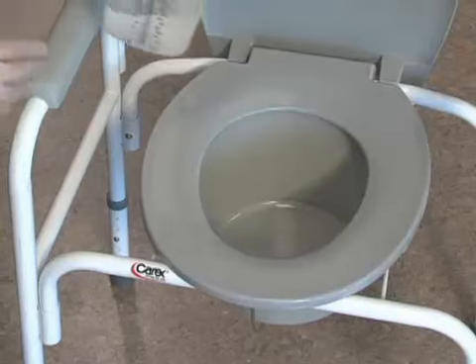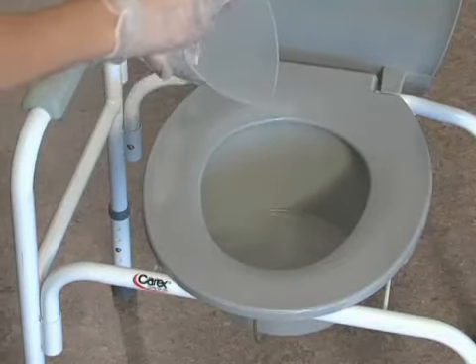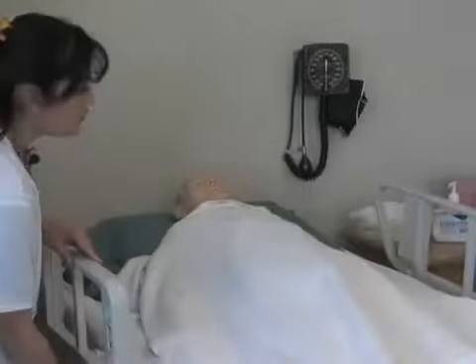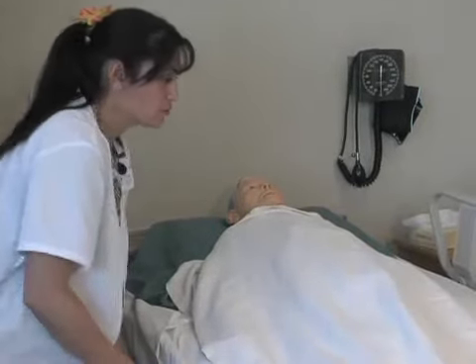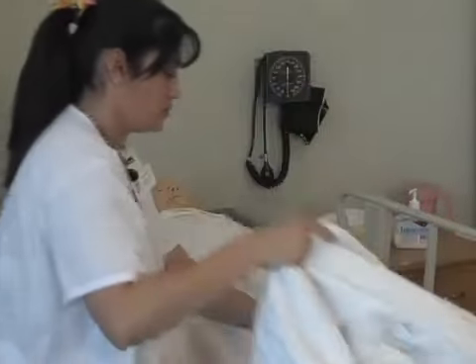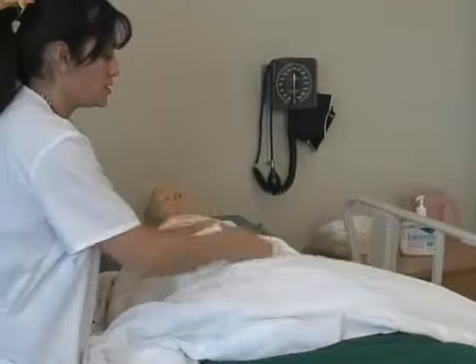So dispose of the contents in a toilet. You're going to wash the graduate, disinfect, and put it away according to facility protocol. For my ending procedures, I'm going to make sure that I cover my patient back. Make sure my patient is comfortable.